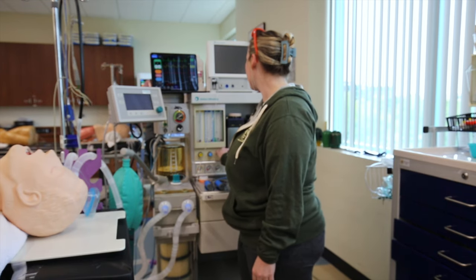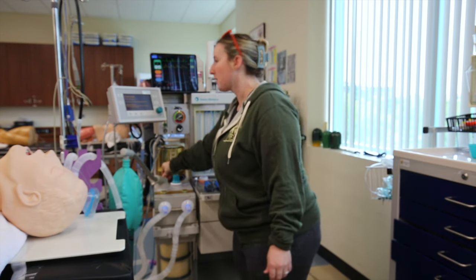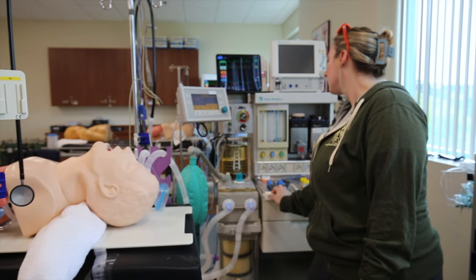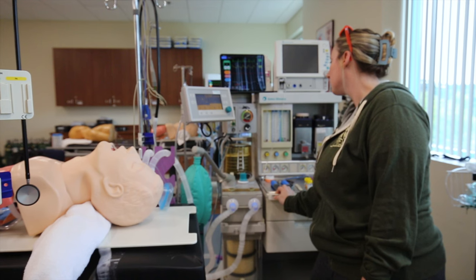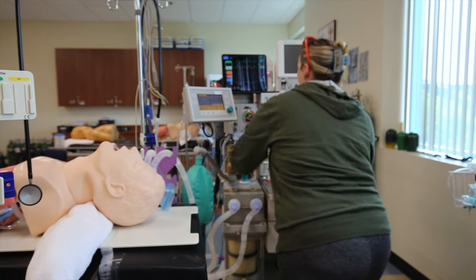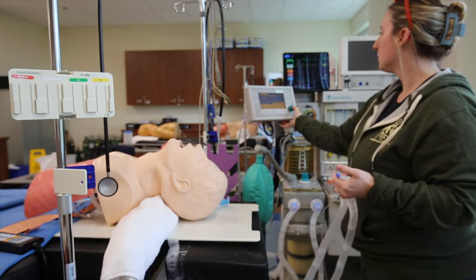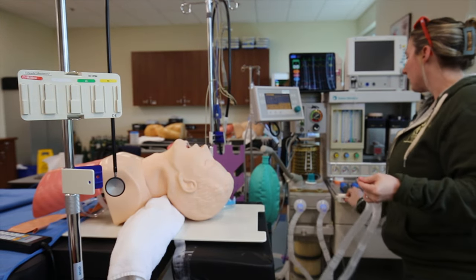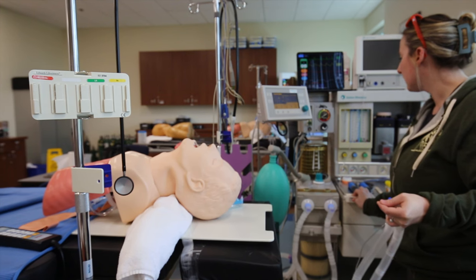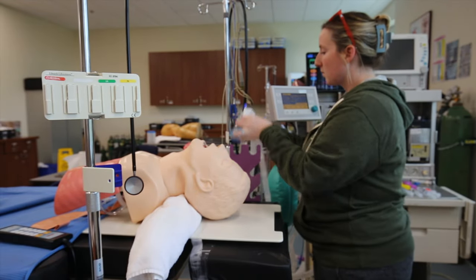I'm going to make sure my flows are off, my vaporizers are off, my APL is open. I'm going to fill my bellows and make sure that my circuit holds pressure. Then I open my APL back up and the air comes out. Perfect.